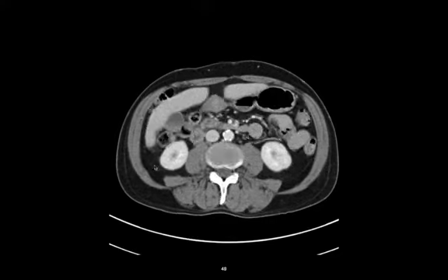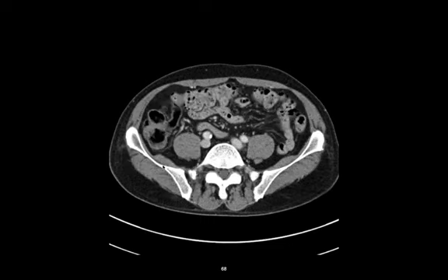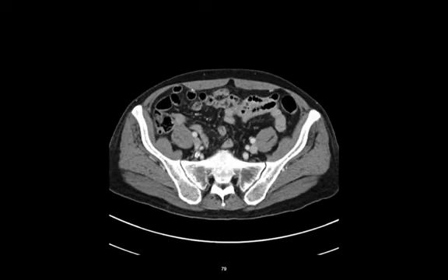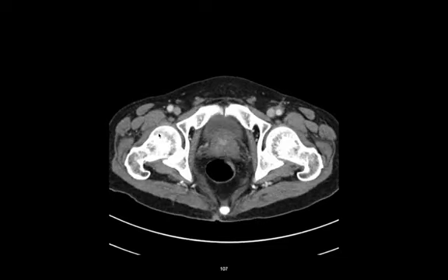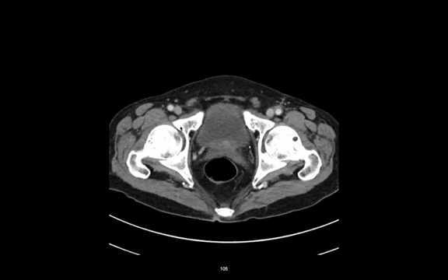We go down and we can see the os coxa that's going to be forming here. Right there is the os coxa, specifically three bones: ilium, ischium, and pubis. That's the ilium that articulates and makes the SI joint. And if we continue down, we're going to see the head of the femur pop up over here like that. Oh, that's so cool when I see that. There's the head of the femur and there's the greater trochanter, and it makes that ball and socket joint of your hip. The acetabulum of the os coxa and the head of the femur make your ball and socket joint.